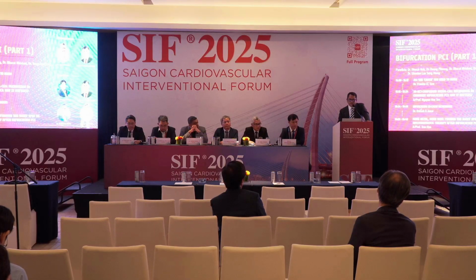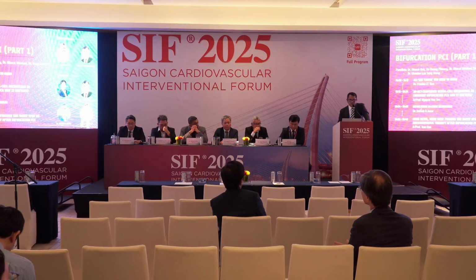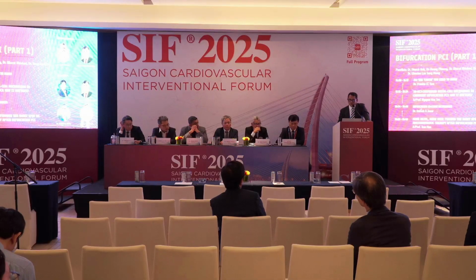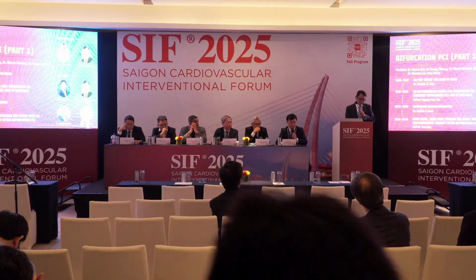Since you're doing a left main, I think the issue if we use DCB is long inflation. And before you decide to do DCB, I think you can use the balloon to see how the patient reacts, or whether you actually need mechanical hemodynamic support to perform the procedure. Yeah, thank you so much.